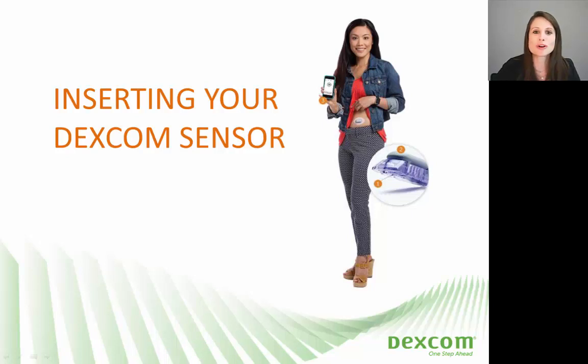Hello and welcome to our webinar on how to perform a Dexcom sensor insertion. My name is Michelle. I'm a certified diabetes educator here at Dexcom. Today I'm going to be demonstrating for you how you'll insert that Dexcom sensor onto your skin.